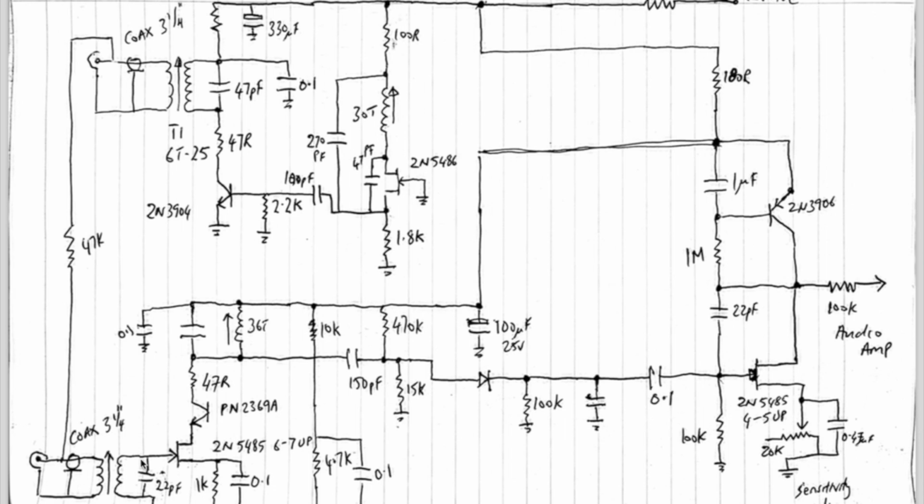So at the bottom here, we've got the receiver section, and I did change a couple of things on this circuit diagram to more commonly available transistors. This PN2369A, you can substitute for a BC547 or something like that, or any bog standard NPN transistor. This base actually connects up there. I forgot to put that in the circuit diagram. That transistor connects there.